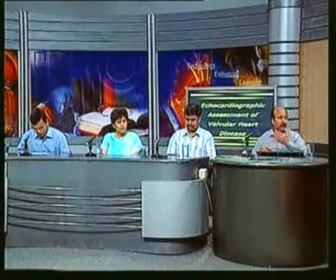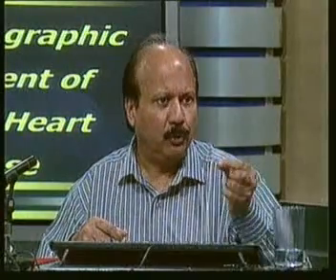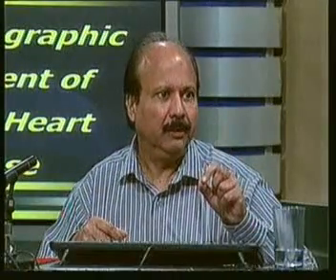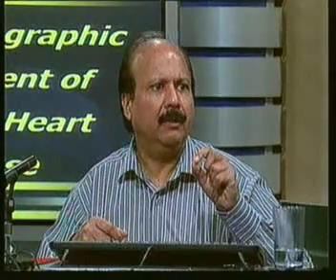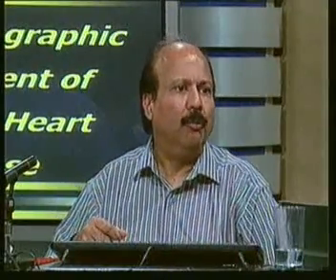And Manish, would you like to add? Yes, that's a very good point. When I mentioned thickness, I should have mentioned that. But what is thickening after all? It is thickened vis-a-vis something which is normal. So if it is more than 4 millimeters, you can easily do it. See, the beauty of the instrumentation is that you don't have to do it with a ruler or a scale. The scale is inbuilt into the machine, very effectively, and you can exactly say, okay, this is 4 millimeters or less.